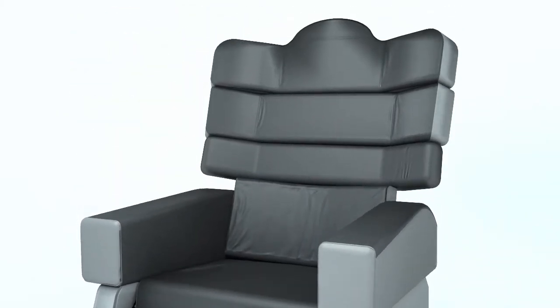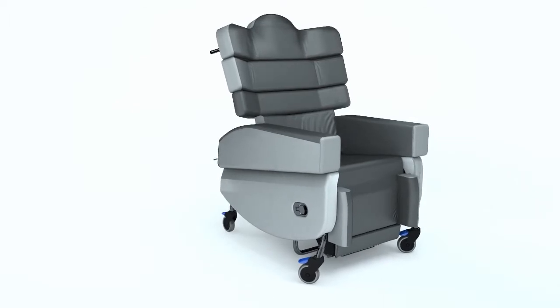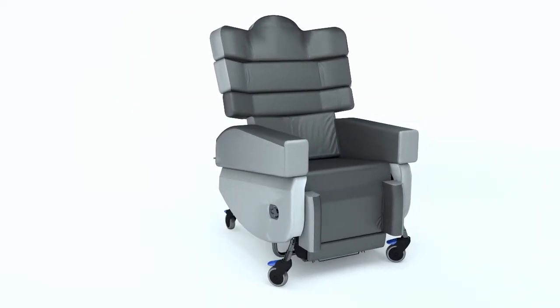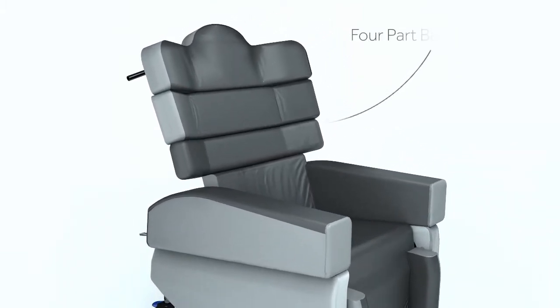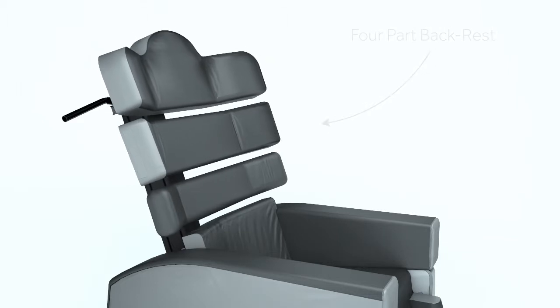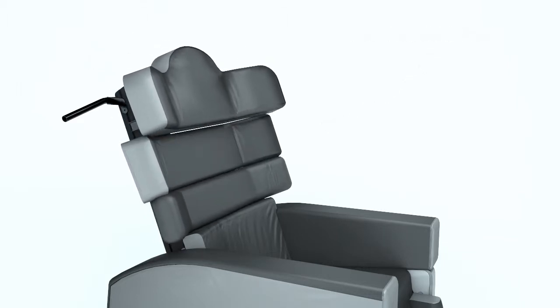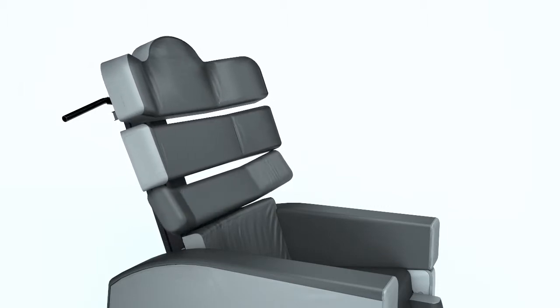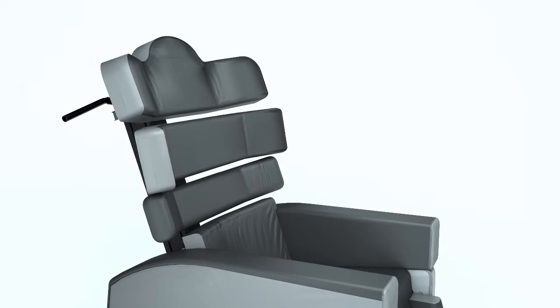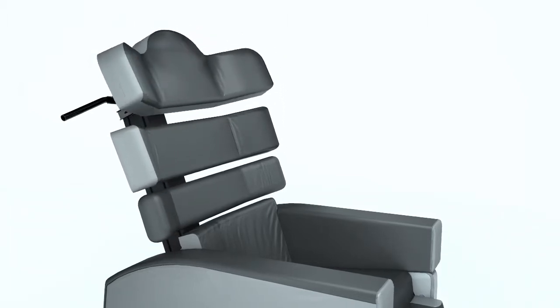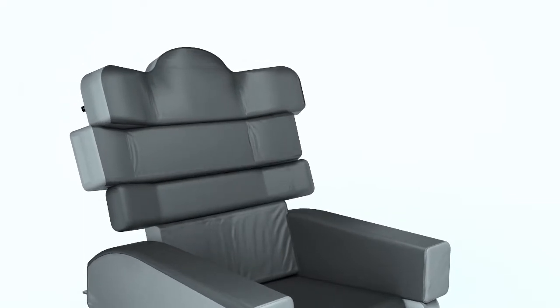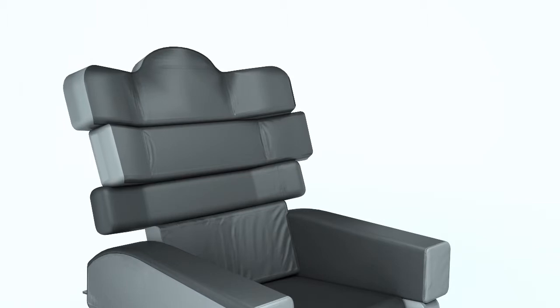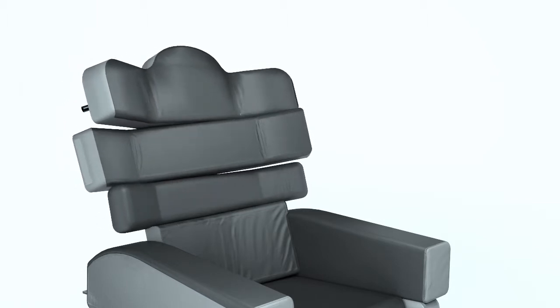The four-part backrest ensures the Smart Seat Pro can be easily configured to suit individual needs, aiding pelvic stability as well as trunk and head alignment. The three upper backrest elements can be adjusted in height, depth, angle, offset and rotation.